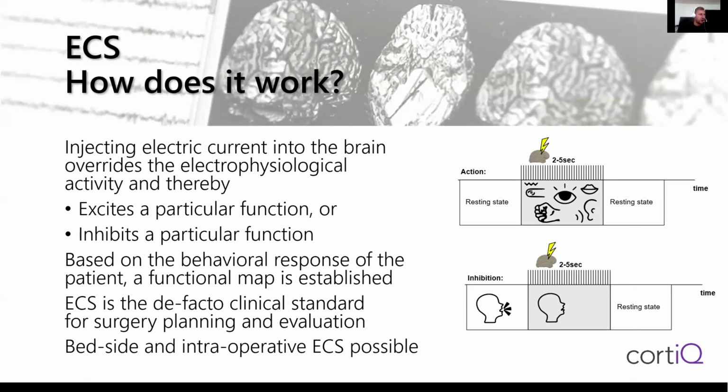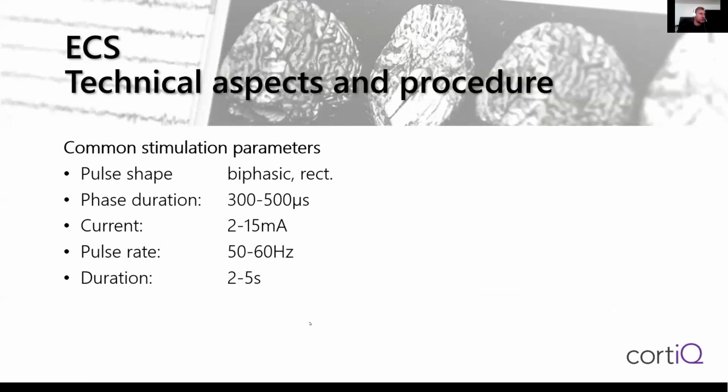And after this monitoring part, it's also important to conduct functional brain mapping, to have a pathological map and a physiological map. With these stimulation protocols, it's also possible to conduct the functional mapping at the bedside after the monitoring, or for example with a handheld probe that looks like a ball point pen, and with that you can touch the cortex or even the white matter and stimulate the brain during an awake surgery. For that the patient has to be awake, and then you can observe the stimulation related symptoms.